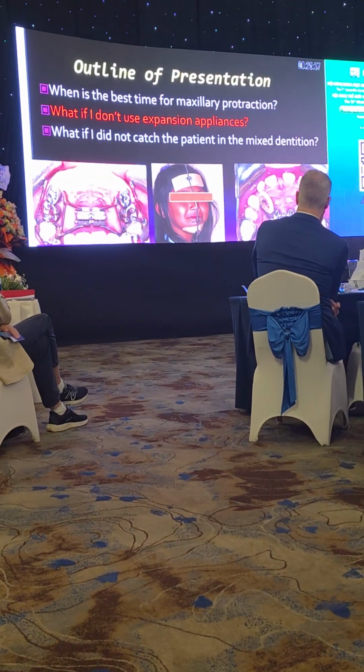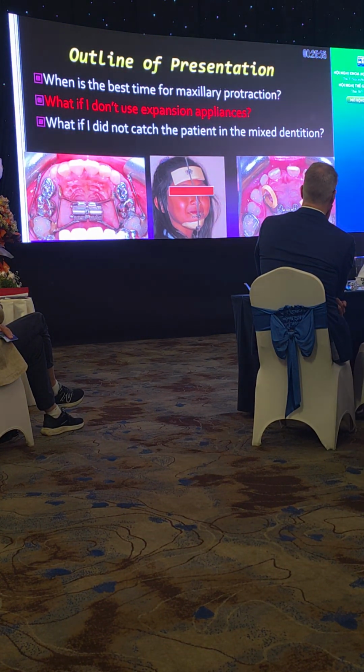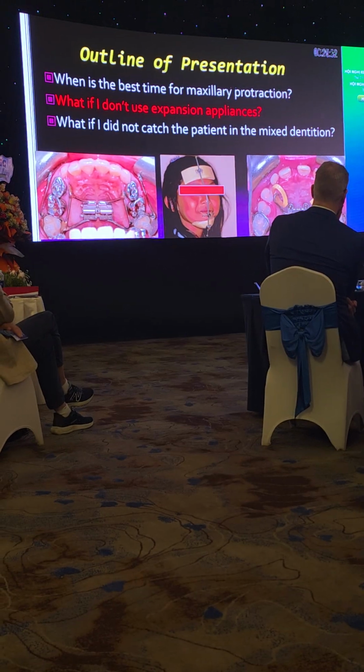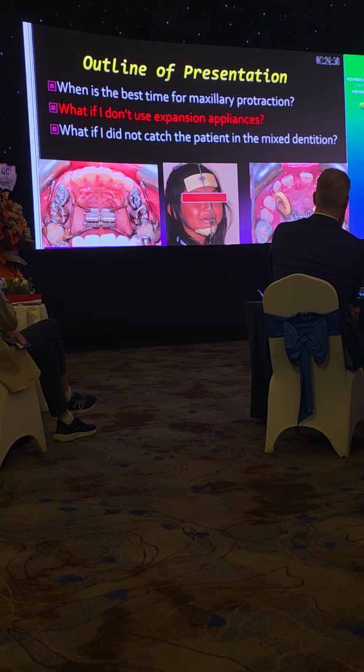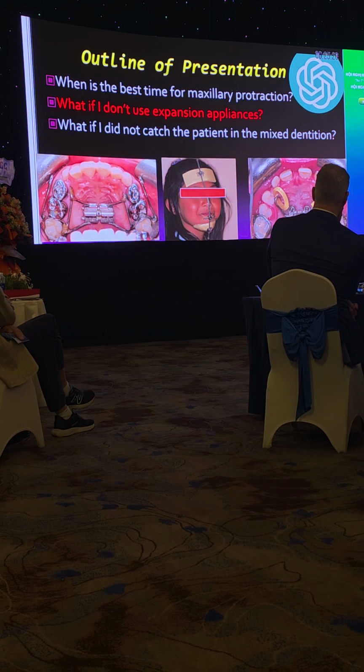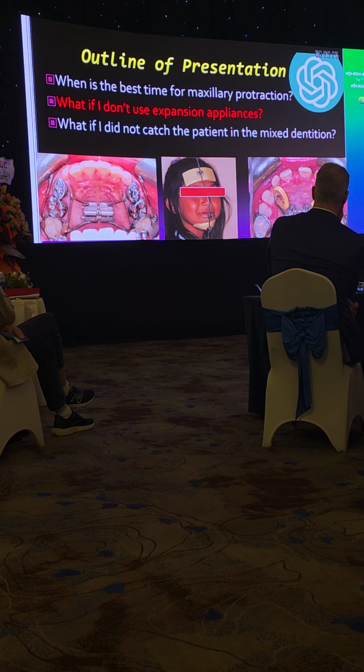Tension applied. Alright? I cannot use the hybrid Hyrax in a mixed dentition if there is no expansion applied for that reason, right? So what should I use? Okay, then I ask ChatGPT.